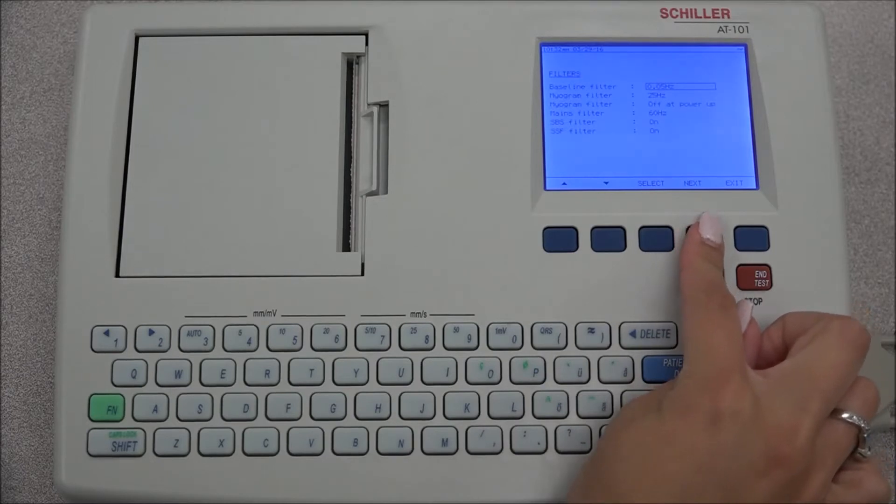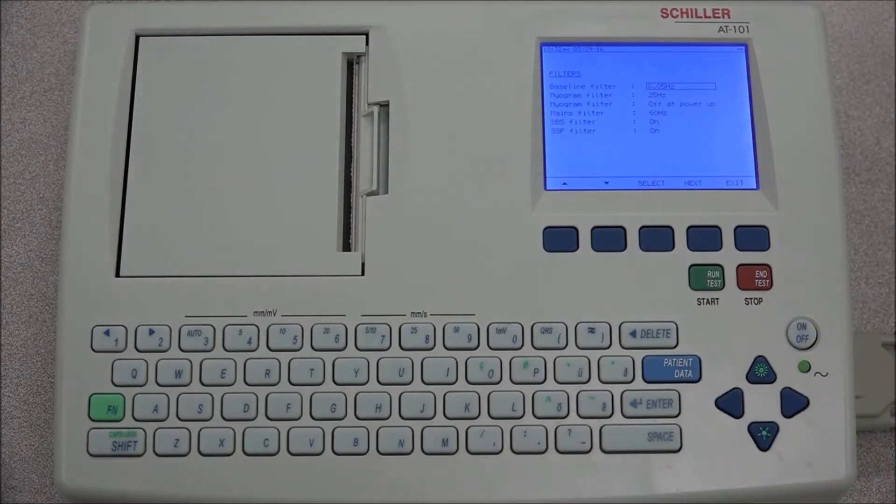Under the filter tab, there are five different filters which can be set individually as follows: the baseline filter, myogram filter, mains filter, baseline stabilizer filter, and smoothing filter.